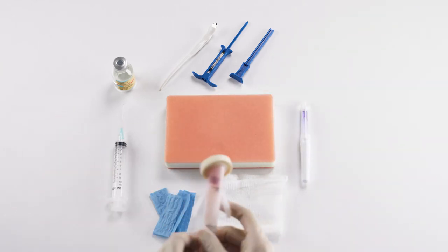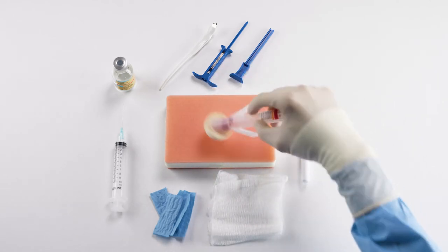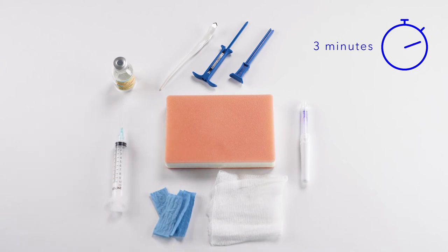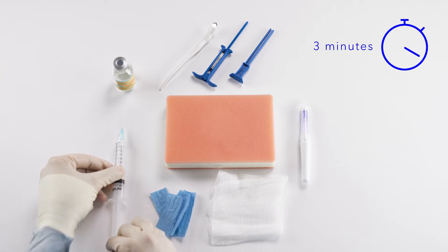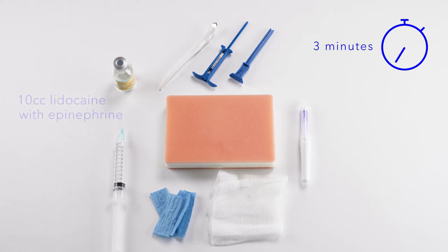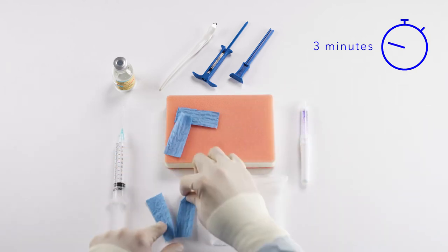We're going to repeat this process one more time — crack it, small circles to big circles in the left chest area — and allow that to dry over the next three minutes. While we're waiting for the chloroprep to dry, I'm going to prepare my 2% lidocaine with epinephrine. I like 2% because it's optimal for patient comfort, and I like epinephrine because it really controls capillary bleeds to keep this procedure as smooth as possible. I recommend using 10cc, no more, as this is the optimal volume for patient comfort covering the pocket and also not overdoing it so as to affect the R-waves. While we're waiting for the chloroprep to continue drying, I'm going to apply four sterile towels on the left chest area as part of our sterile technique.